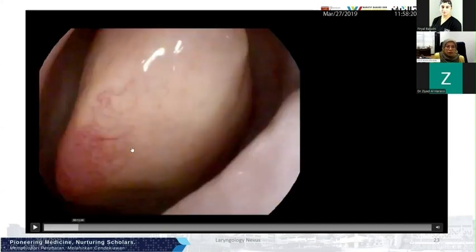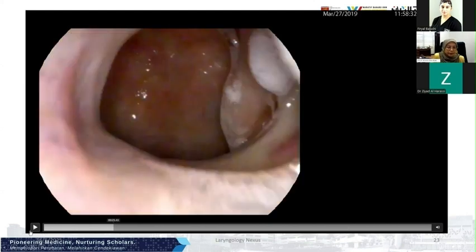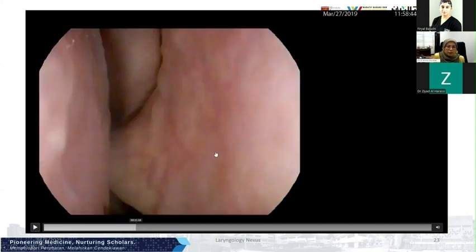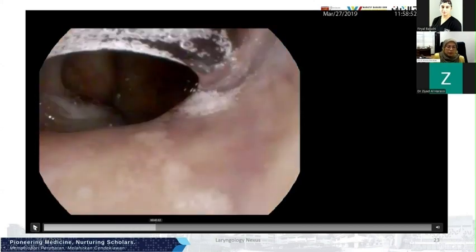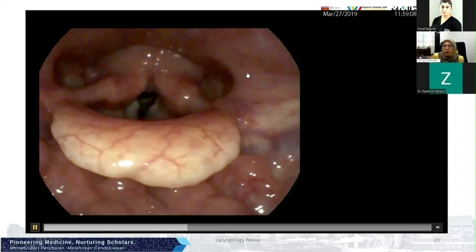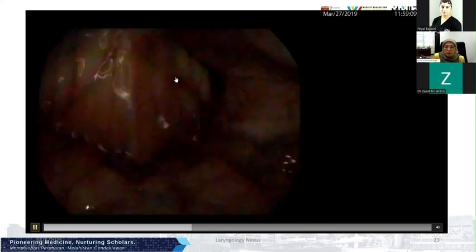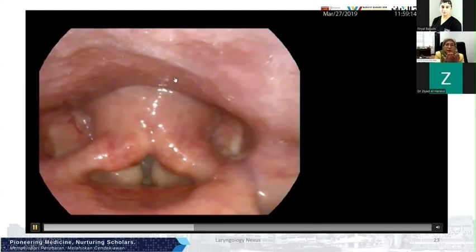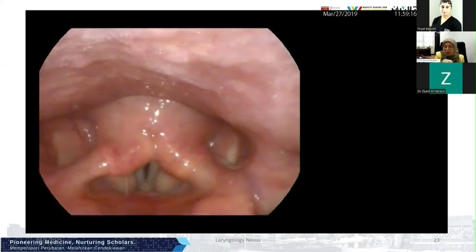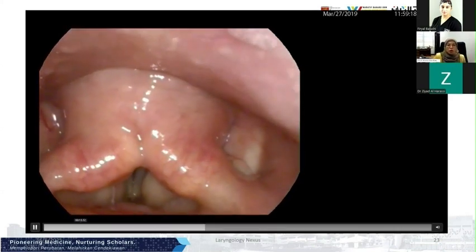We still can't tell what's wrong with the vocal fold. And then we turn on the stroboscopic light. So I hope you can appreciate that. She has an hourglass closure, and during the closed phase, only the midpoint meets up. It shows that there is already some edema over there. If she doesn't receive treatment, that may progress into vocal nodules.